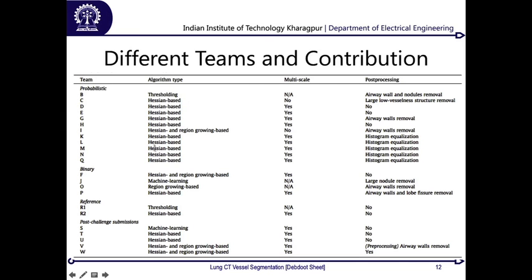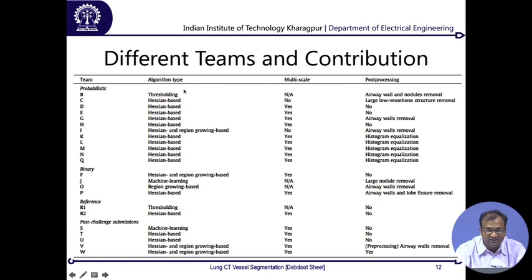But what I wanted to predominantly say is that if you look into their approaches, you can broadly classify them into probabilistic approaches, one of which uses thresholding, and most of them use the Hessian based approach. So either they go down by Frangi's native method of taking the eigenvalues corresponding to the eigenvectors of a Hessian decomposition, or they use a Hessian decomposition and then on top of that use some other operators or learning engines in order to build on top of it.